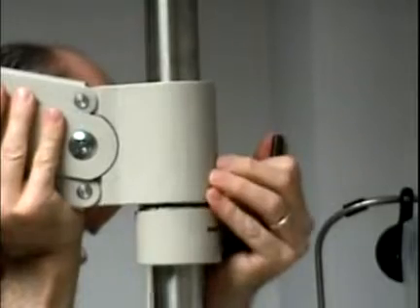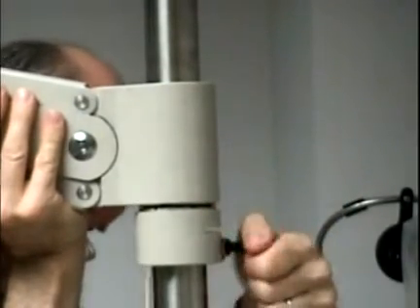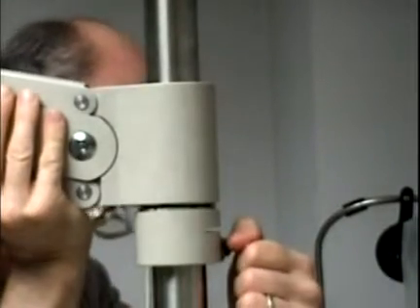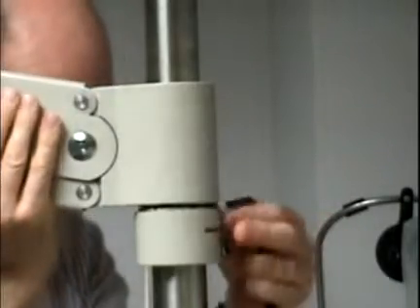The phoropter arm is locked in place by a large Allen wrench — I believe it's like an eight millimeter.